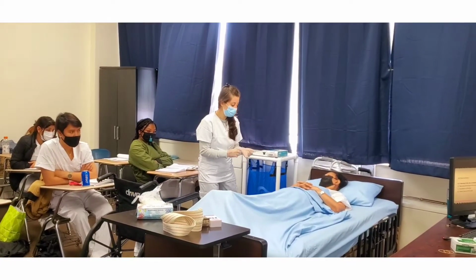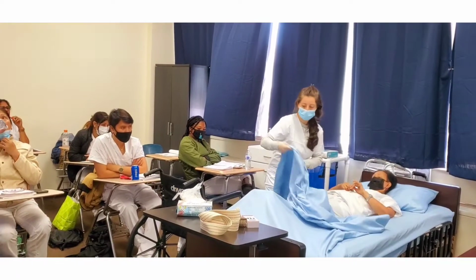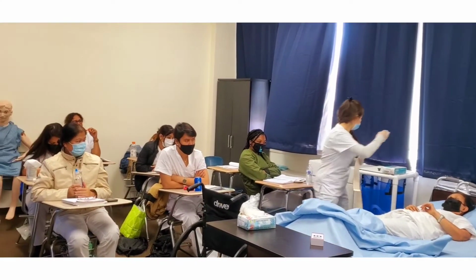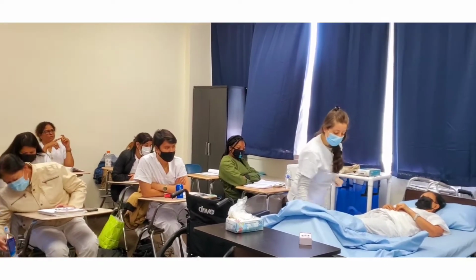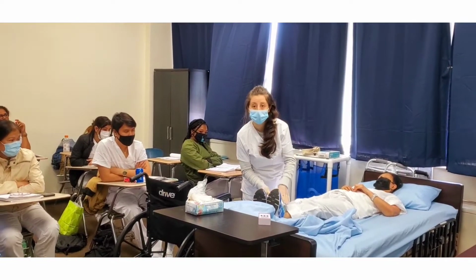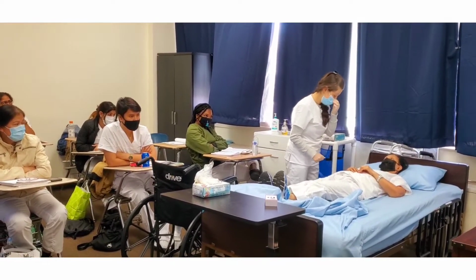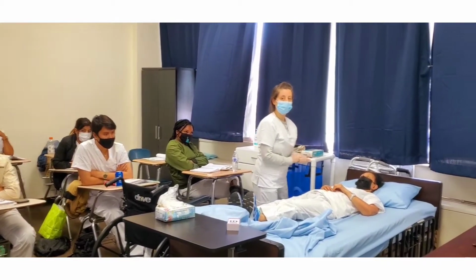Okay, Ms. Carpio, I'm going to slowly fan fold your sheet. I have my gait belt here. Ready? And let's say I placed shoes on her already, so she has non-skid shoes. Very good, to prevent any harm done, right? The non-skid shoes and socks are to prevent falls.